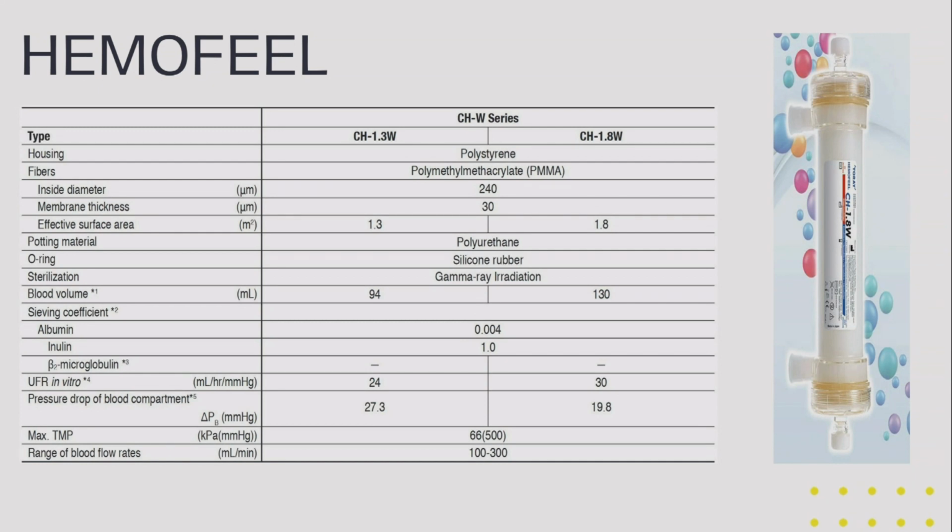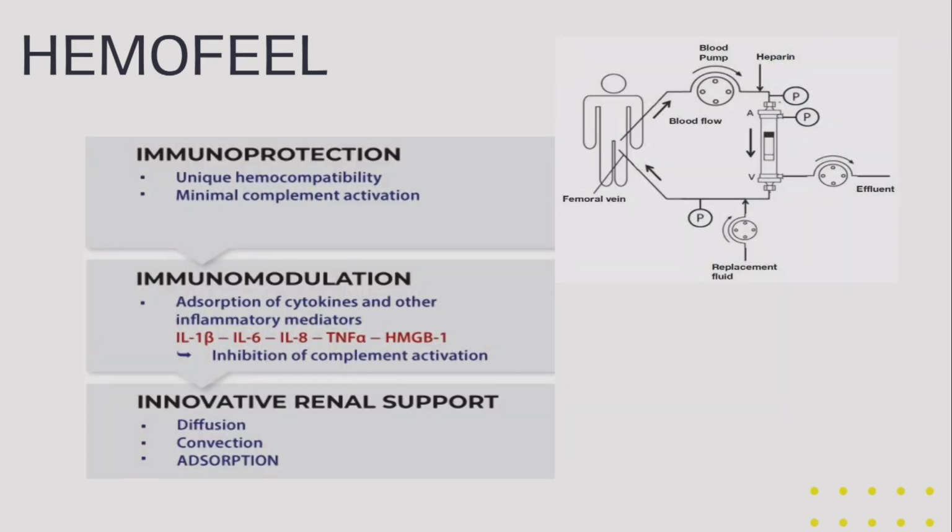This particular membrane is a PMMA membrane. This PMMA membrane gives us the benefits of not only immunoprotection, but also immunomodulation, and it is a renal support also. So we can run a dialysate on the other side. It works just as a SLED membrane.